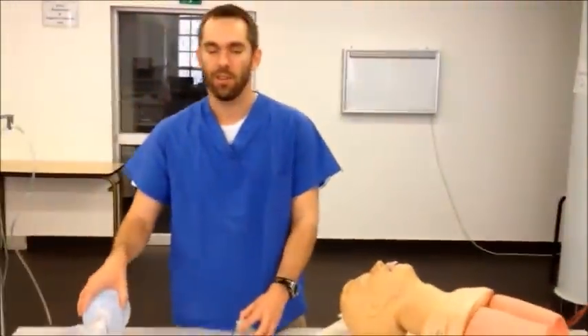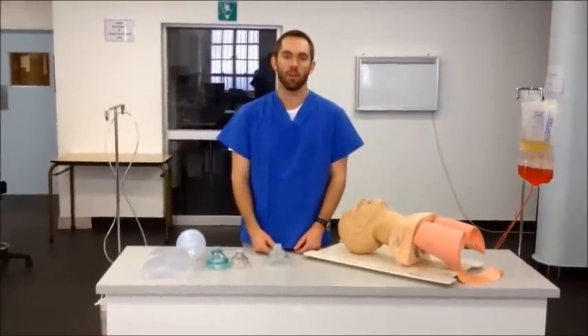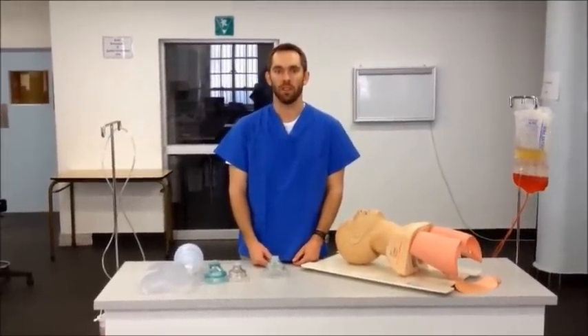And that's it — correct use of a self-inflating bag valve mask device for assisted ventilation in patients with breathing problems.